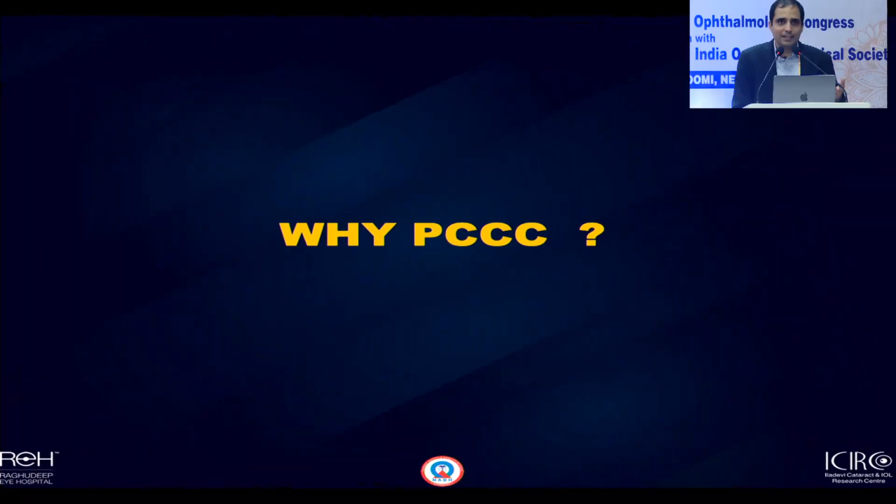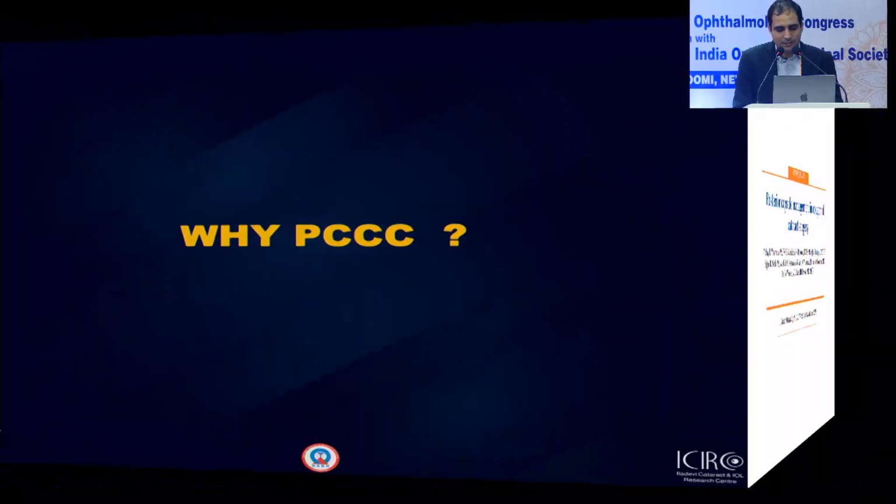So primary posterior capsulorhexis is actually part and parcel of pediatric cataract surgery. But why is primary posterior capsulorhexis necessary?